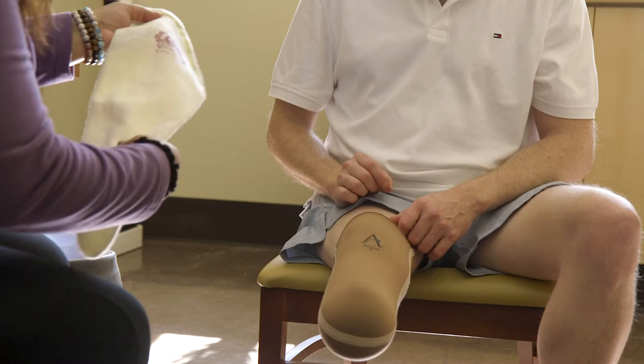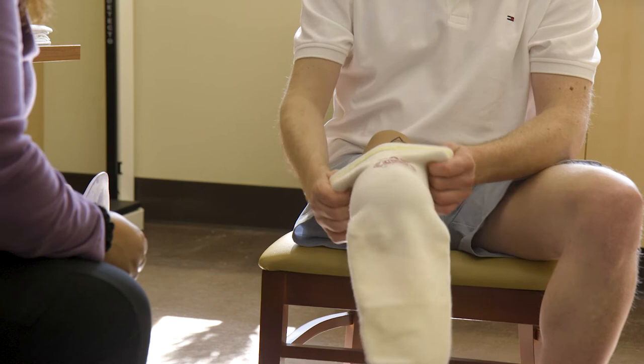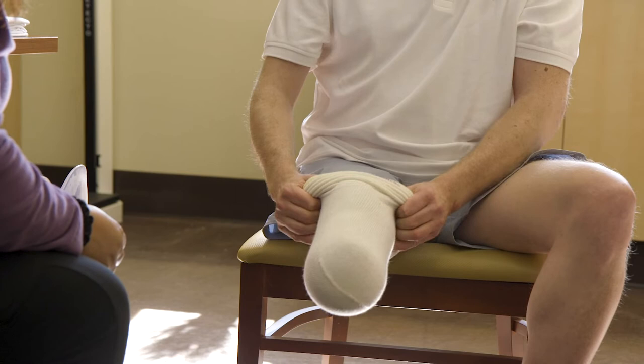Manage prosthetic sock use carefully. Prosthetic socks help to keep a proper shape to your residual limb and fill the space between your limb and your prosthesis. Carry a few of these socks with you and adjust them as needed, as the size of your residual limb may change during the day.